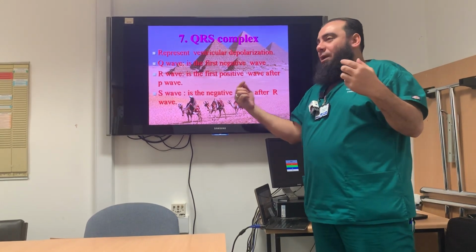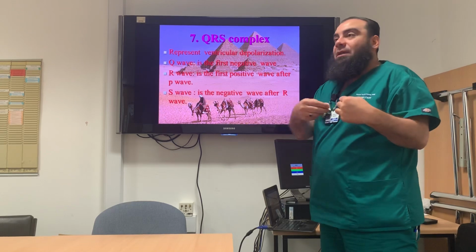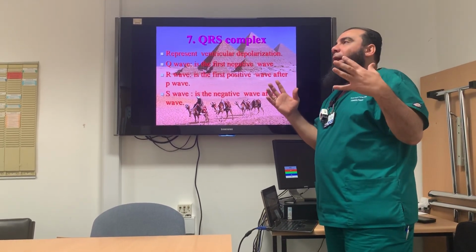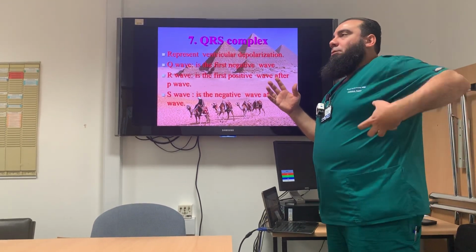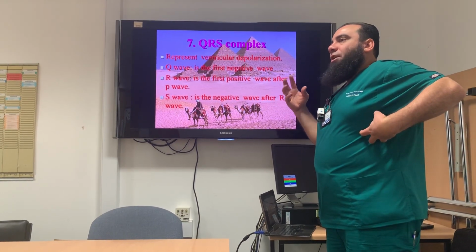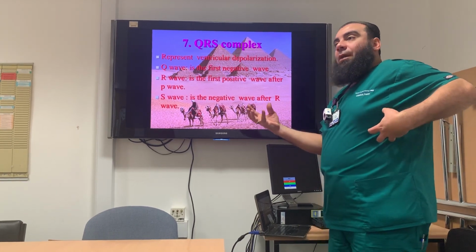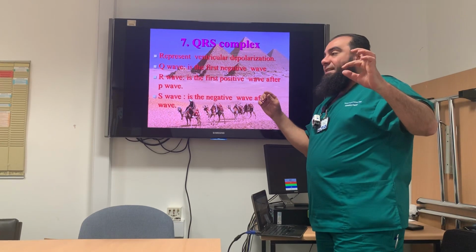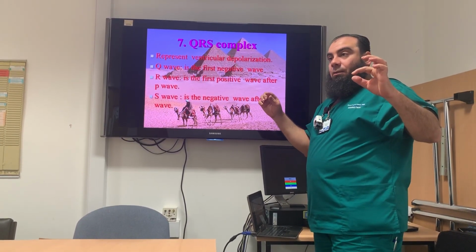Wherever the leads look at the heart, it reflects what can be seen there. So if I close my eyes, I can imagine V5 and V6, which record the left ventricle, and I can see a very big R there with a diminished S and Q if present. Is that right? And so on.